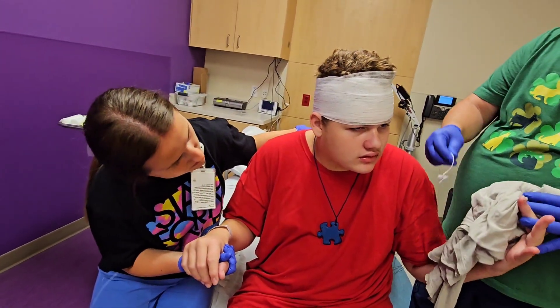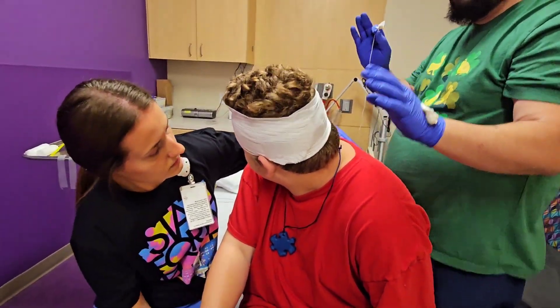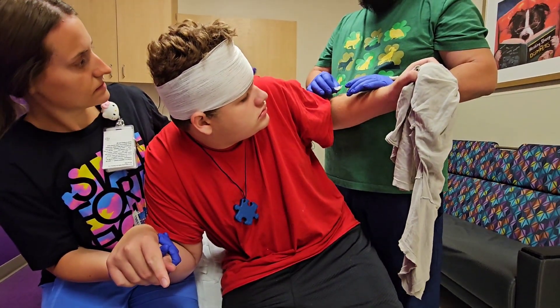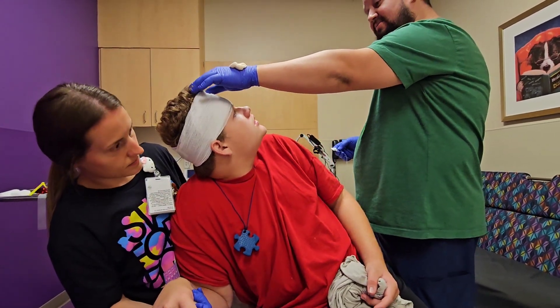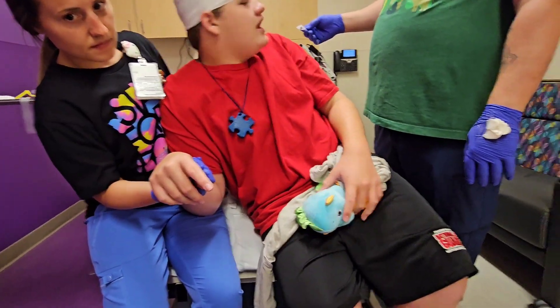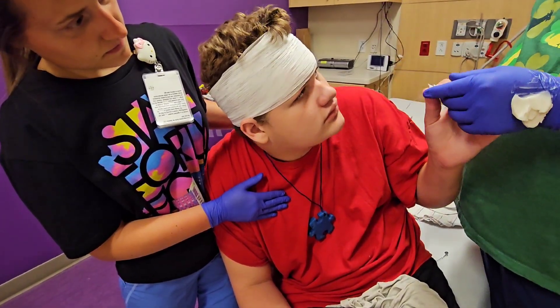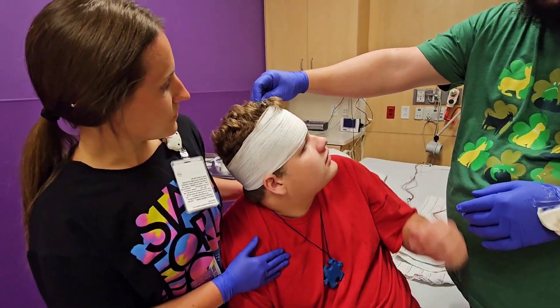See, does that hurt? No, it won't hurt. It hurts here like this — ready? It's okay, right there. Remember, it's okay. Trust him Bubba, I know it's okay. You did so good so far — see, no pinch, no pinch. Hey, if it hurts we're gonna leave Bubba, if it hurts we'll leave. See that was it — look, does that hurt? No hurt, no owies. One, two — see, no, it's just cold, look, just cold. We gotta put them up here on your head — ready, up here. Here, hold your seahorse Bubba, it's okay. Do some guitar, here — up, down, here do this. If I hold your hand like this I'll hold your hand — there you go, hold hands. No owies, look, see it just sticks on your head, that's all, just sticky sticky. JJ you went this far, let them put those on buddy, and we go right up here — look, there's one, yay!